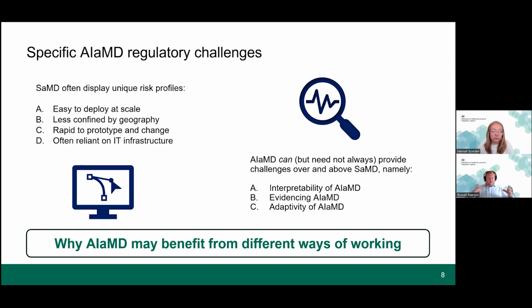So that's to give an idea of the software layer of virtual product risk that we're trying to manage through our various means here at the agency. But just diving another layer down into AI products, which again is a subset of software products, we've bundled together a couple of areas which, whilst not necessarily specific to AI in some cases, are often exaggerated or seen more acutely in the AI product space. So taking these 3 broad categories into consideration. Interpretability, explainability, the ability to understand how the product's working, how the information can be trusted by end users, how the human-computer team can actually be maximized to be efficient. All of this stuff is quite complicated in the AI space.